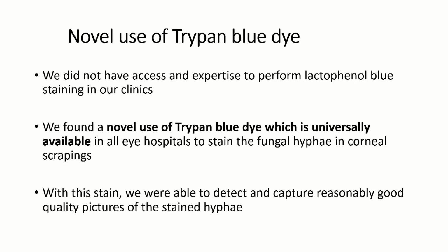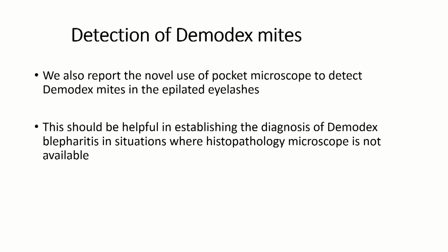We did not have access or expertise for this stain in our clinic, so we used Trypan blue dye, which is universally available in eye hospitals, and with this stain we were able to detect and capture reasonably good pictures of the stained hyphae. We also report the novel use of pocket microscope to detect Demodex mites in epilated eyelashes, and this would be useful to make diagnosis of this entity in situations where histopathology microscope is not available.